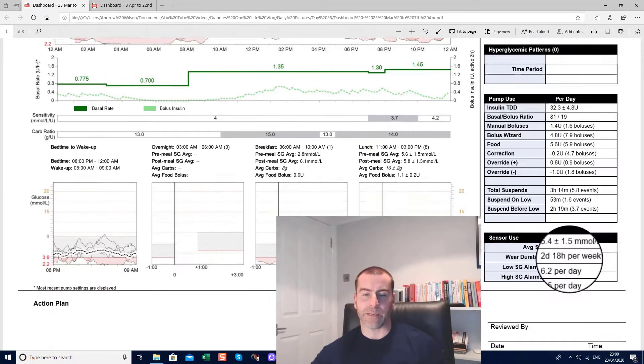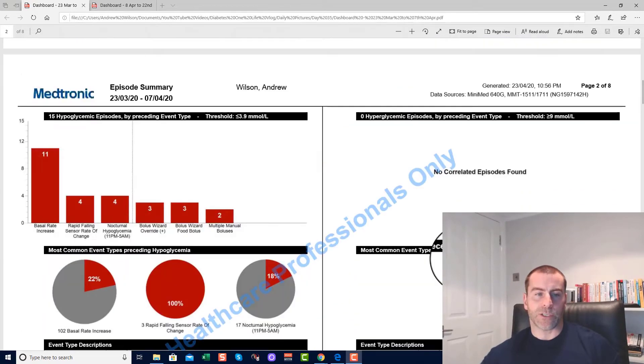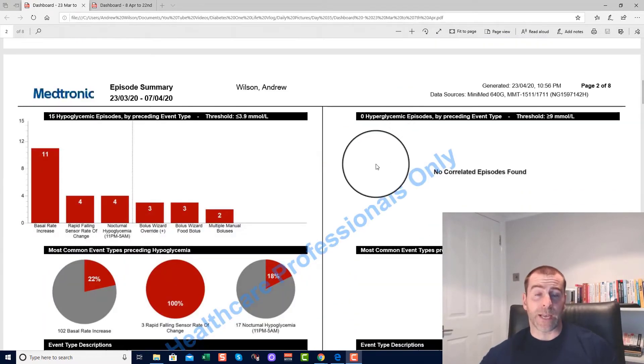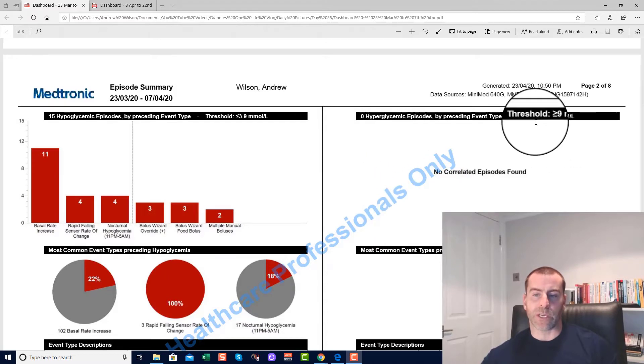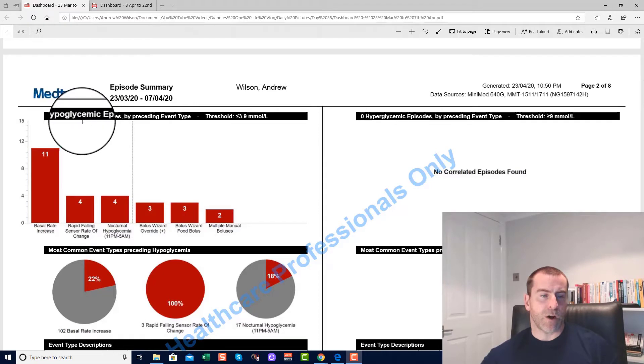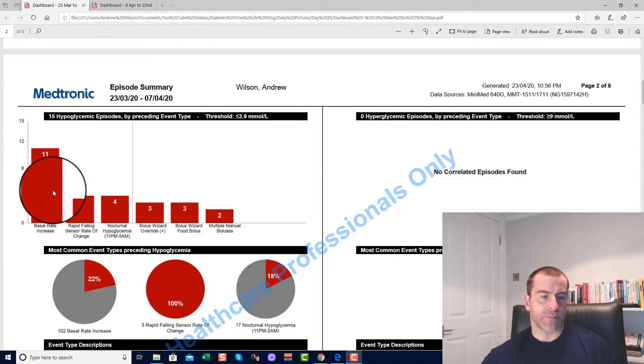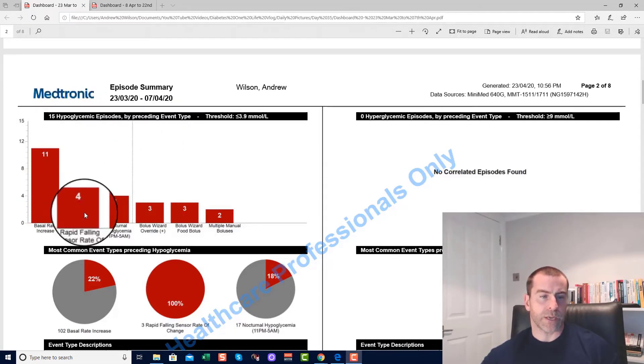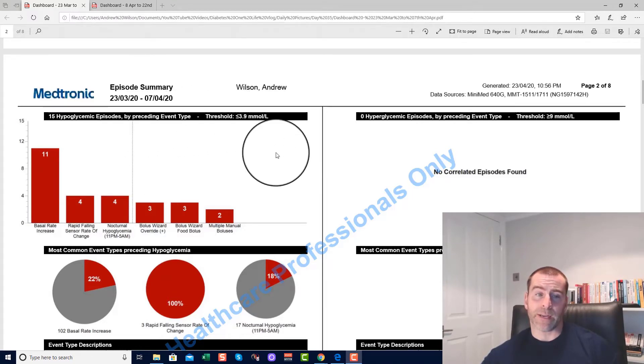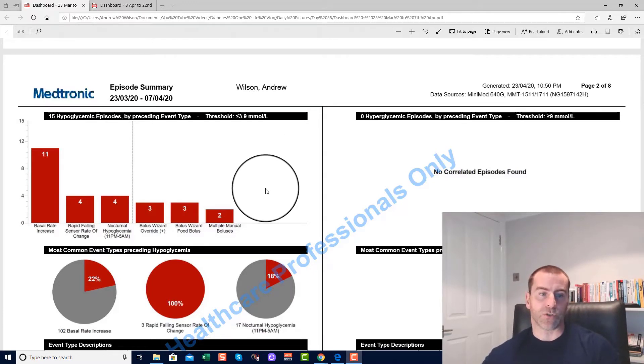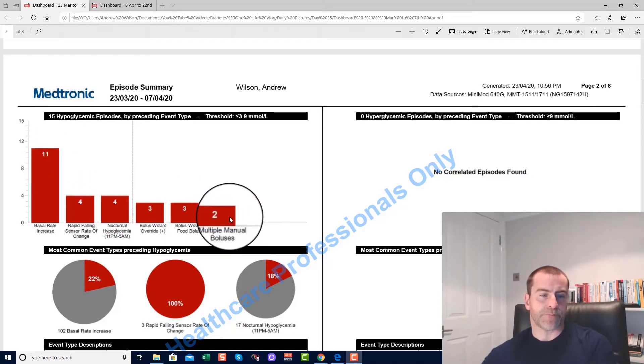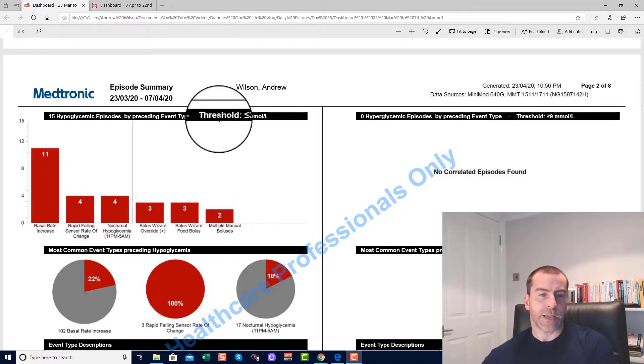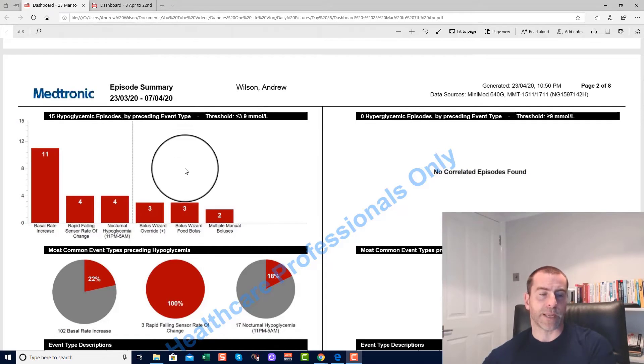The next page shows exactly what I was saying to you before. No experiences of hyperglycemia, which is over 9, but there were 15 hypoglycemic episodes, where the threshold for that is 3.9. So that's quite low, really. For some people that's awfully low; for me at times that's not too bad. But you can see here there are 15 hypoglycemic episodes.